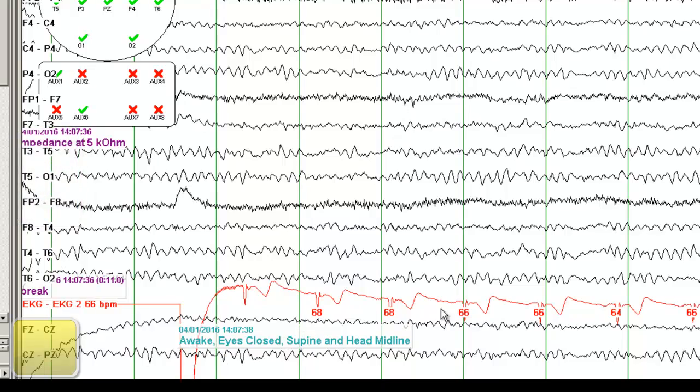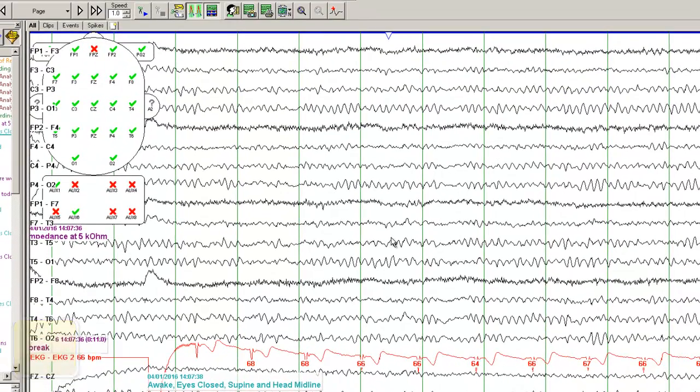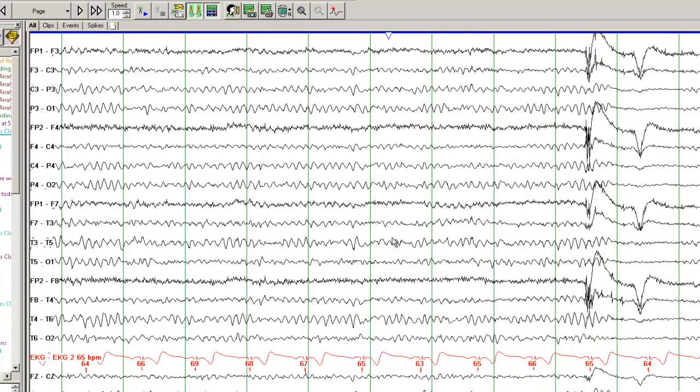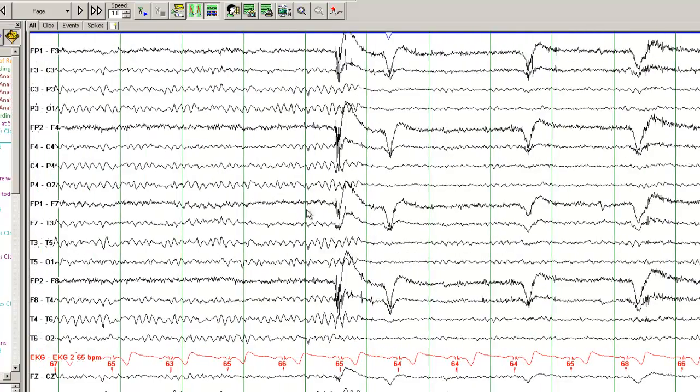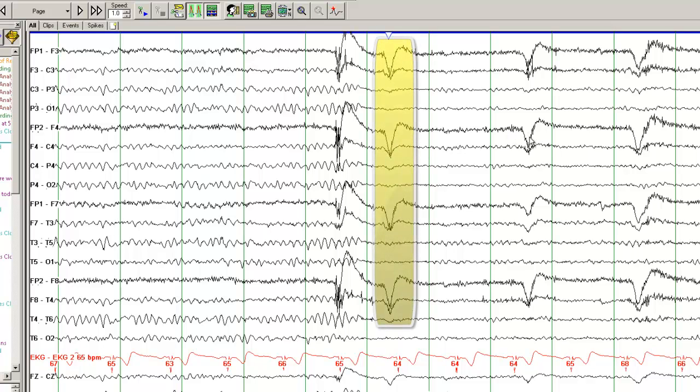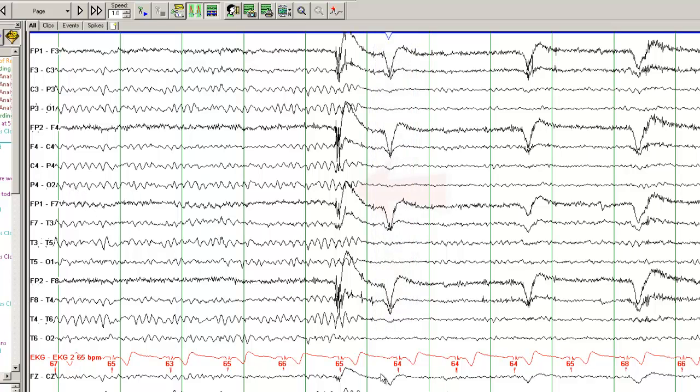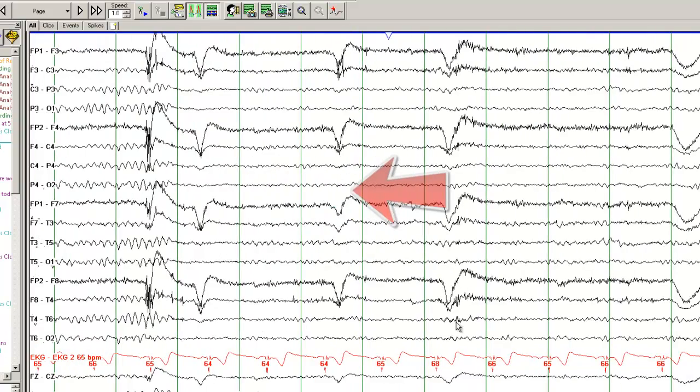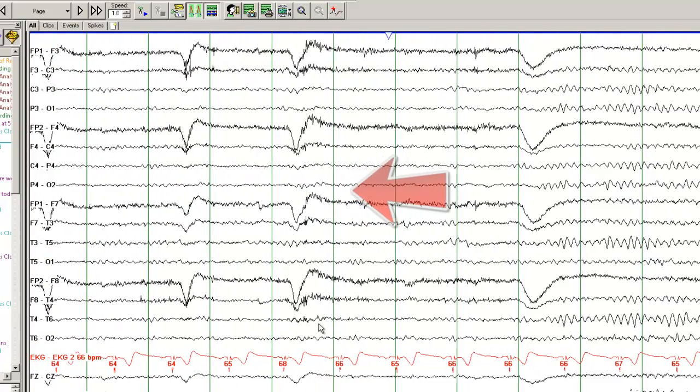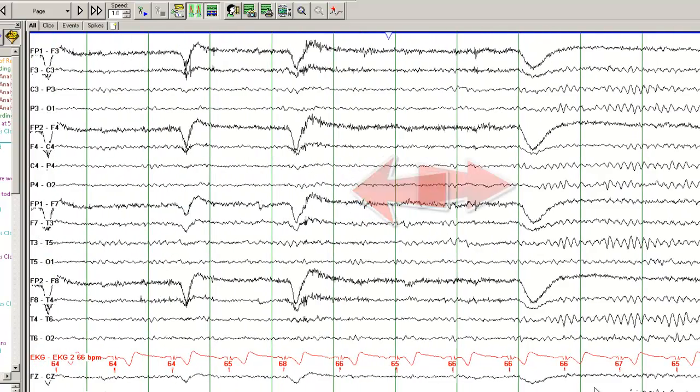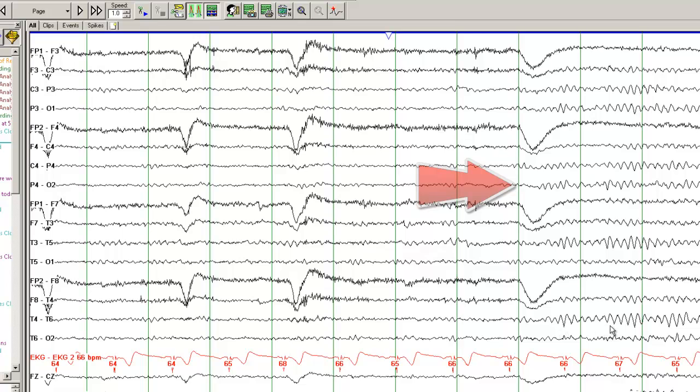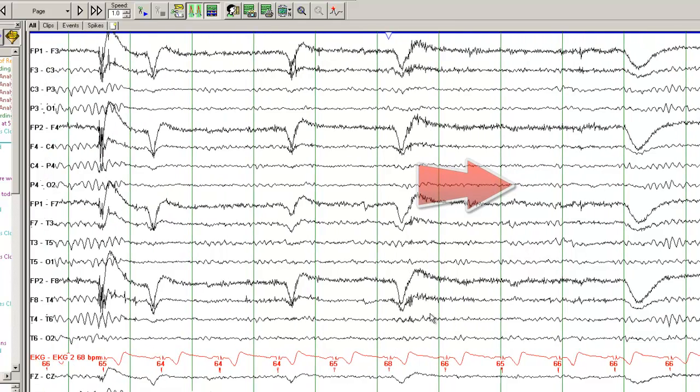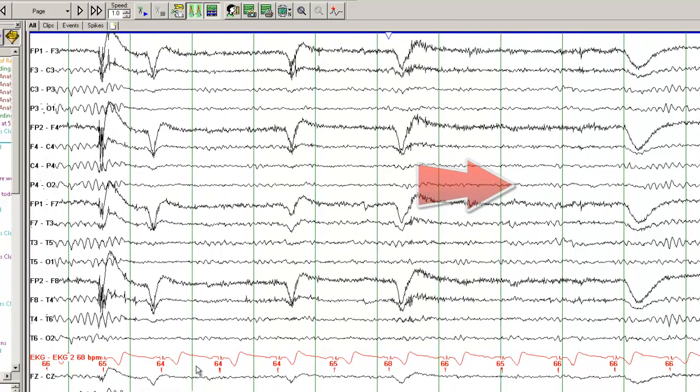We are also recording the ECG in this patient, and I will move on on the EEG. These are eye blink artifacts. This EEG is reactive to eye opening, so as the patient opens the eye, the alpha rhythm disappears, and as the patient closes the eye, the alpha rhythm reappears. So this is an EEG that is reactive to eye opening and eye closing.